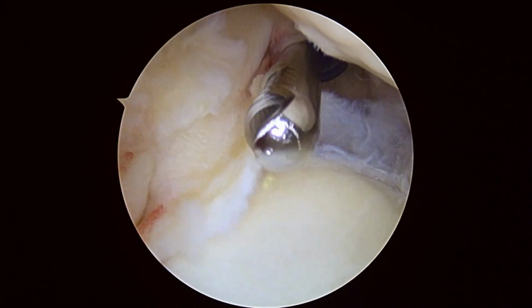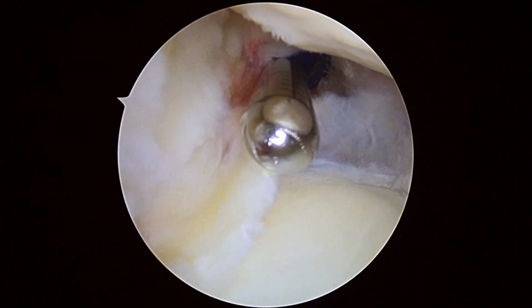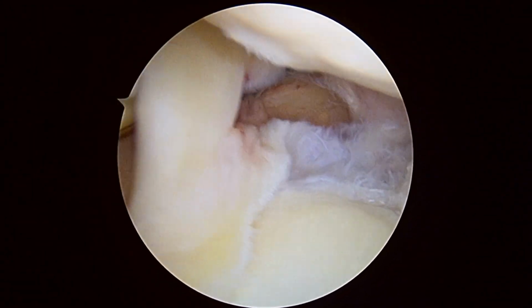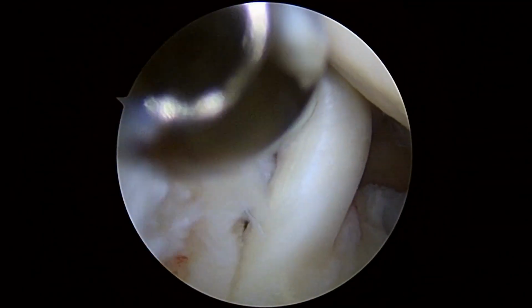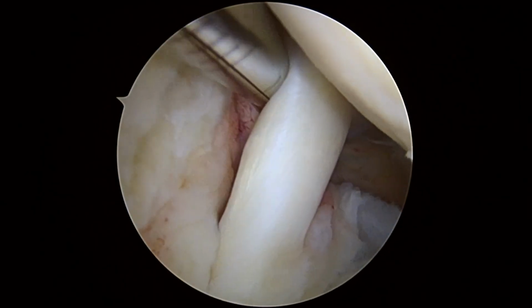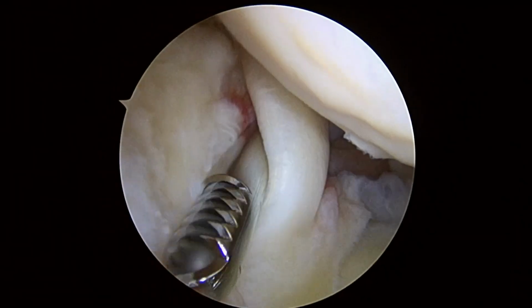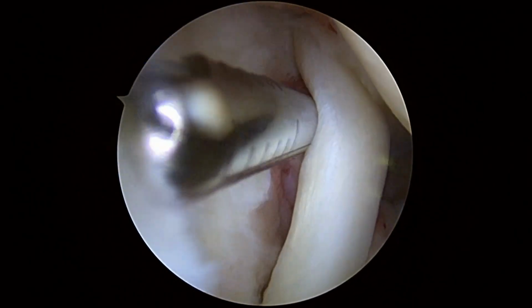So we're going to be doing what we call a biceps tenodesis. To the left here, this is the rotator cuff tear, and we're going to have to repair this today also. So we'll get our anchors and our suture hooks ready to go. Right now we're just cleaning things up enough so that we can see.